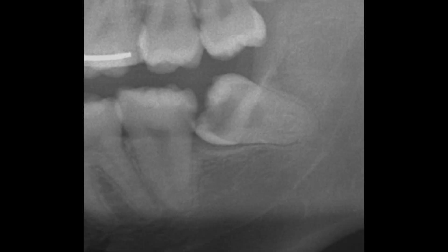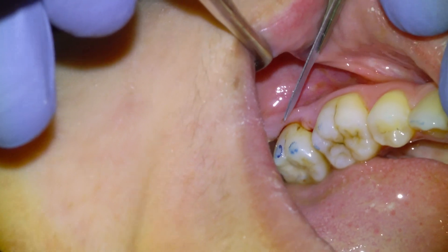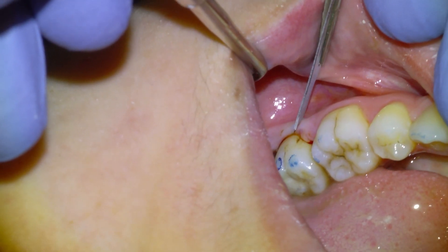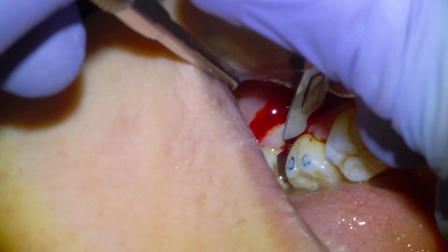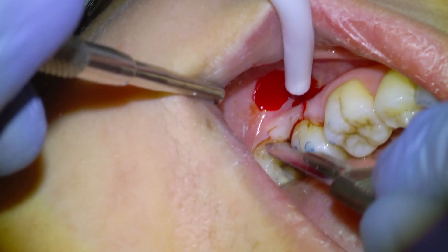Now we're going to get going with the wisdom tooth. Here's a panoramic showing the wisdom tooth with a huge cavity responsible for the pain and a millimeter or two separation from the inferior alveolar nerve. So we're not too concerned about probability of mandibular nerve damage in this case, but we'll always advise the patient that it's a possibility.